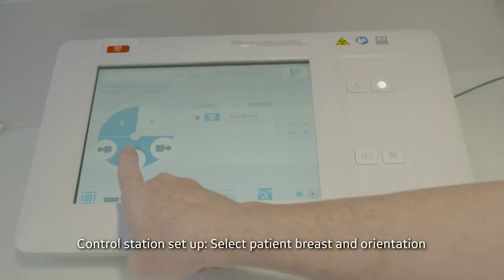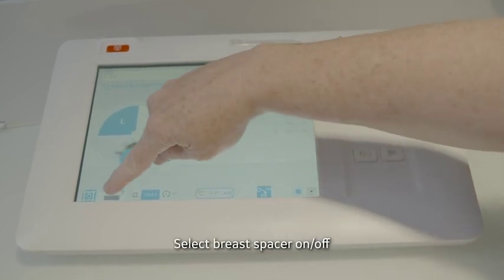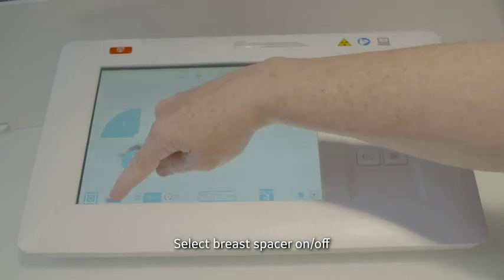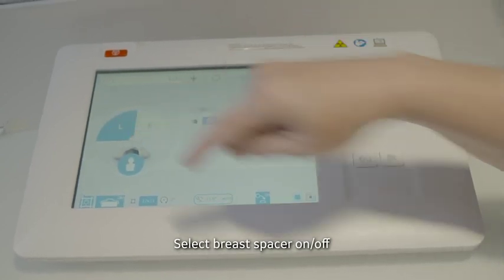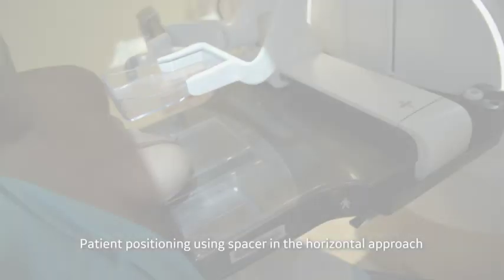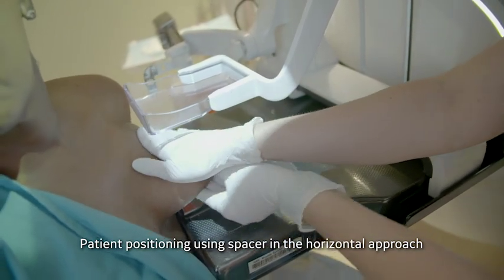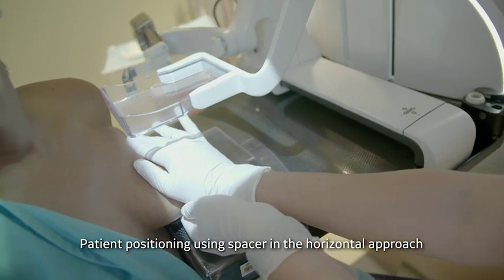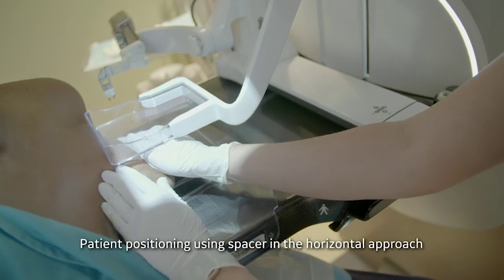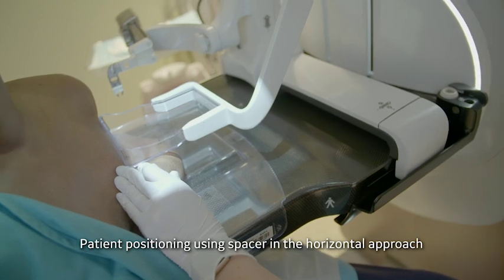Left breast. The patient is seated. We indicate if the breast spacer is used — in this case, yes. The technologist positions the patient directly onto the breast spacer, which is used to maximize the thickness of the breast.